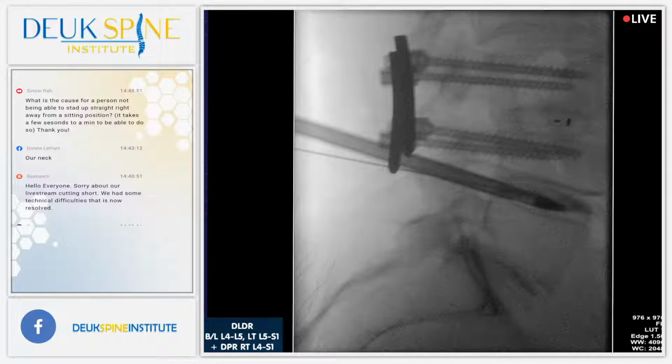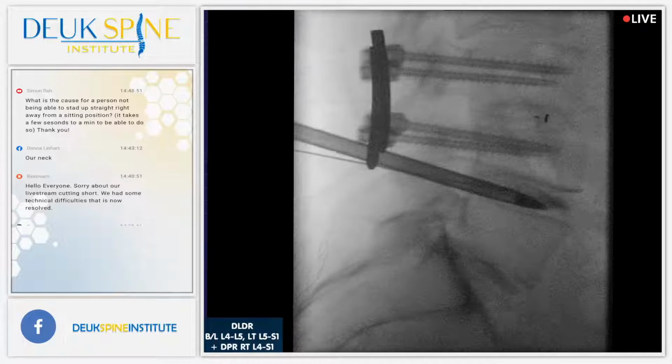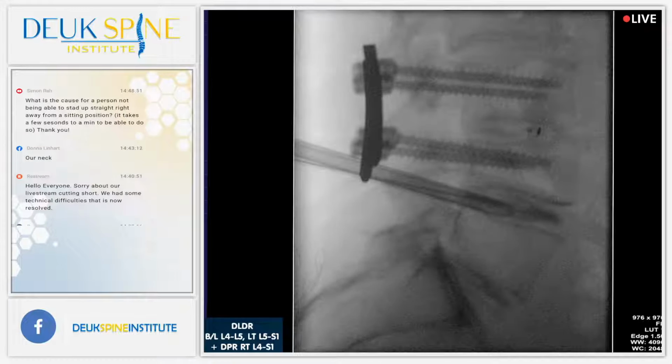Sometimes the dilator will push out just as you're putting the tube in, and you've got to stop and replant it, because if you don't, you're going to have a problem. Shot. That looks good. All right, get the fluoro out. We are in position to start our second Deuk laser disc repair.